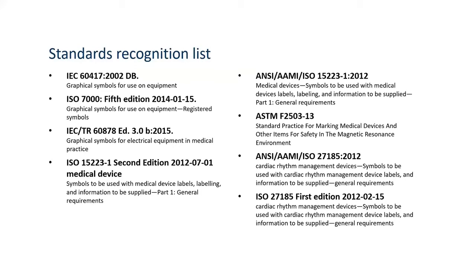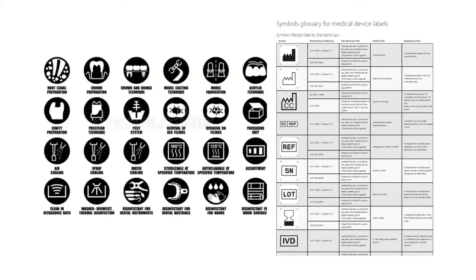All of those are codified, and it's an extensive list of standards that you've got to be aware of as you design these. There's just a picture of some of the icon development that the FDA, they're not very keen on anyone going off the reservation. These things are codified, and they want them used in a systematic way.